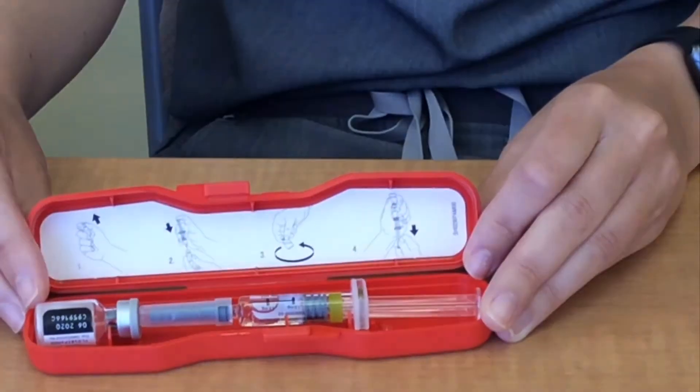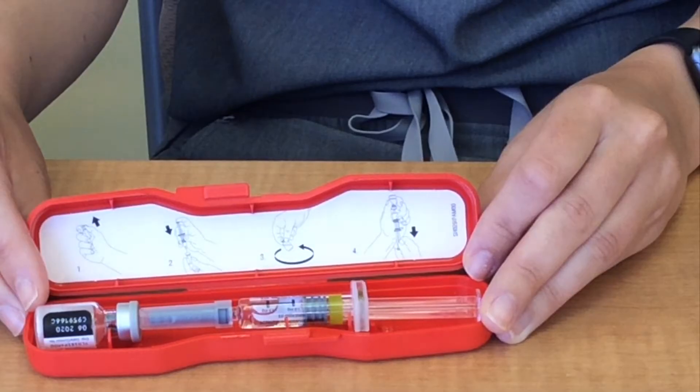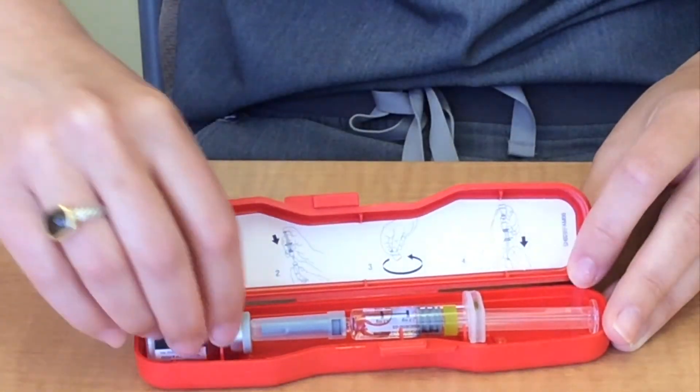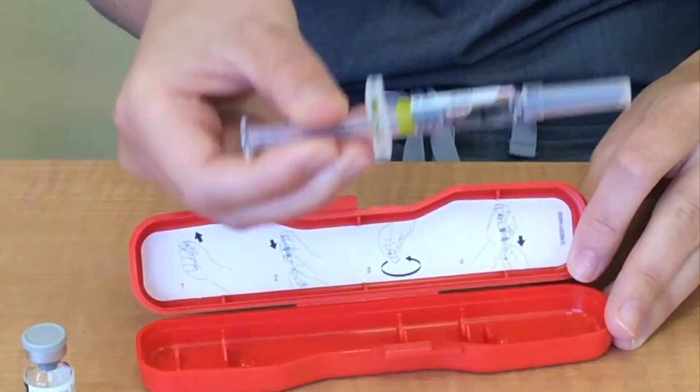How to use an emergency kit. Glucagon is injected into the muscle. It is important that family members and loved ones know how to use glucagon and when it is appropriate to use it. Glucagon comes in a kit. Inside the kit you'll find a vial with powder medication, a syringe with liquid solution in it, and step-by-step instructions on how to use it.